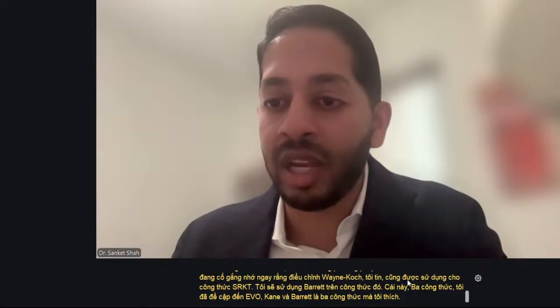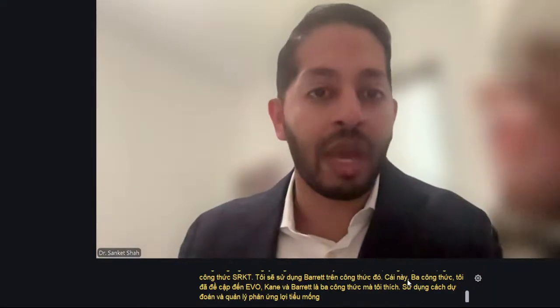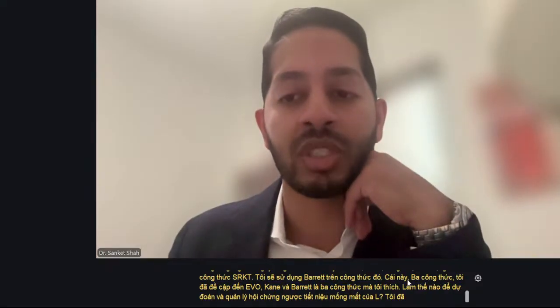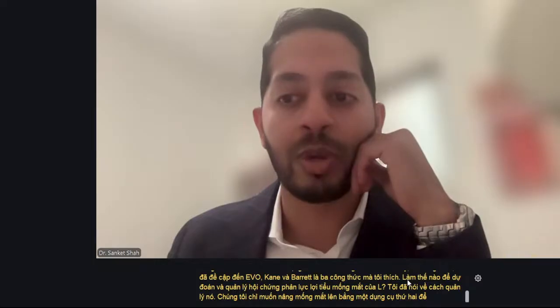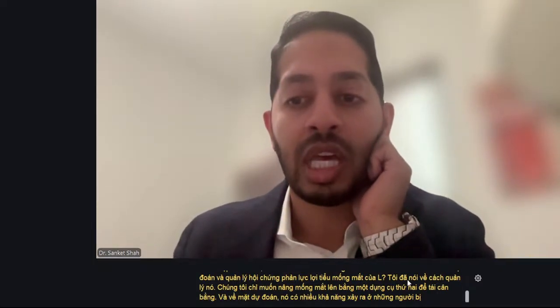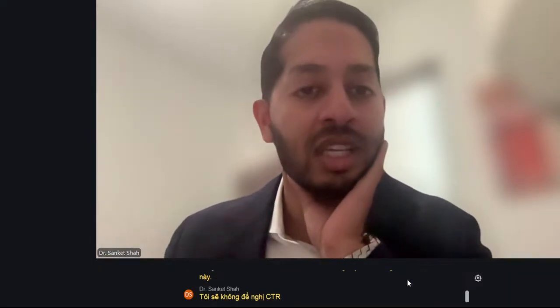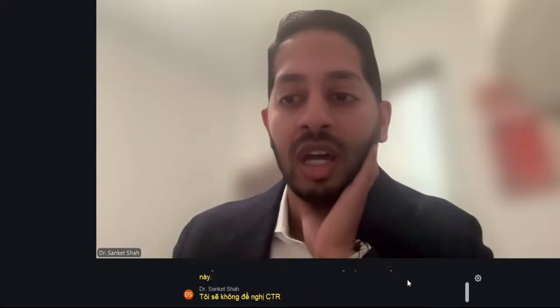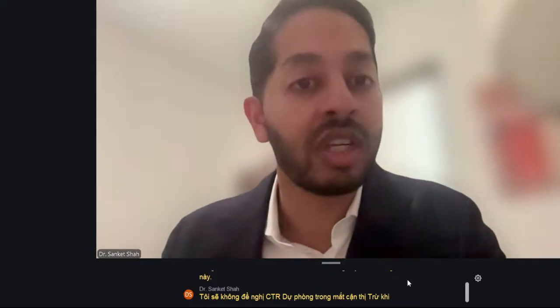How do you predict and manage the lens iris retropulsion syndrome? I talked about managing it. We just want to lift the iris up with a second instrument to re-equilibrate. And as far as prediction, it's more likely to happen in these high myopic patients. I would not recommend a CTR prophylactically in myopic eyes unless you see zonular dehiscence during surgery.